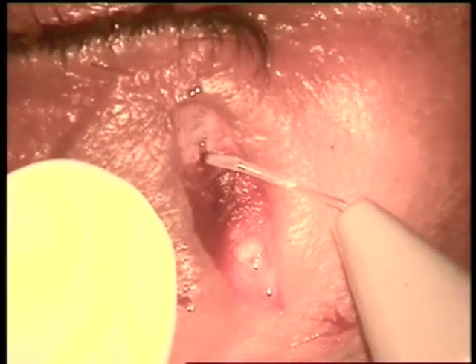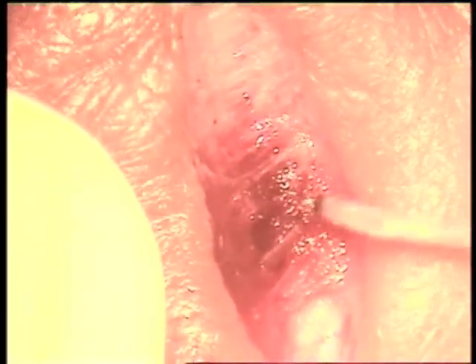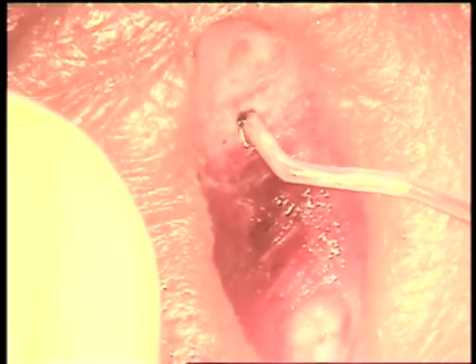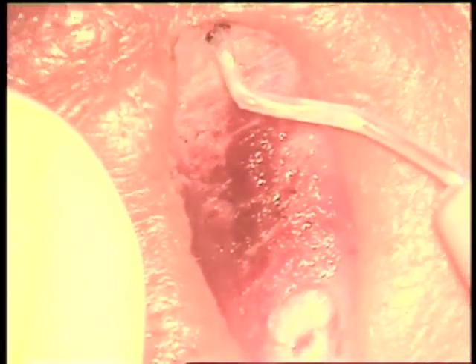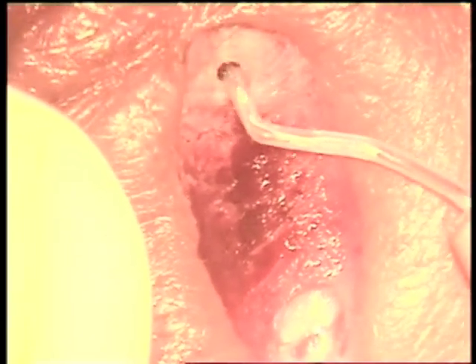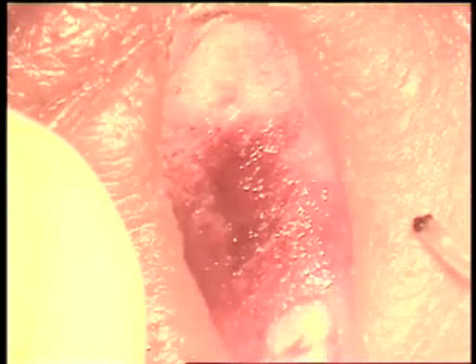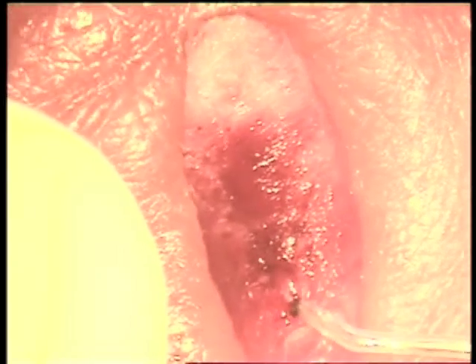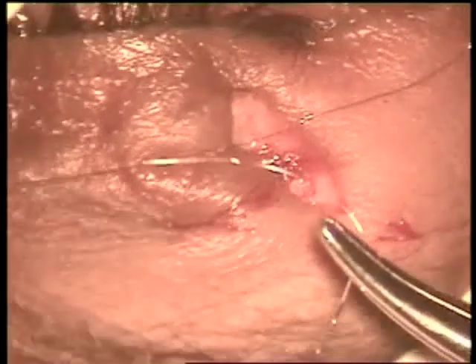We also preserve a little bit of muscle in front of the tarsal plate. Look how thick these orbicularis muscle fibers are. Once in a while you can have bleeding from the incision line. In that case we use a 600 micron tip of fuga blade at medium or high intensity, and that stops the bleeding. Rarely we need an artery forceps to control the bleeding.